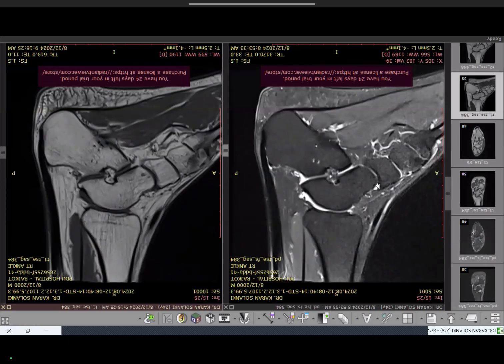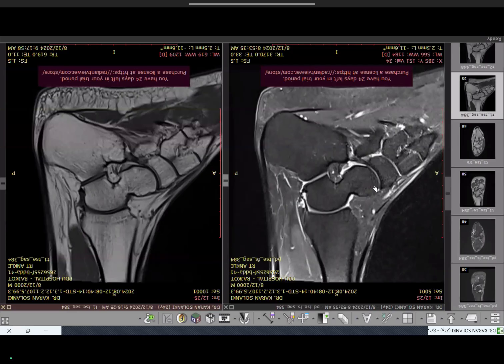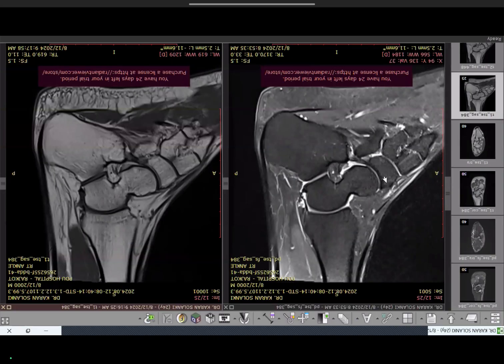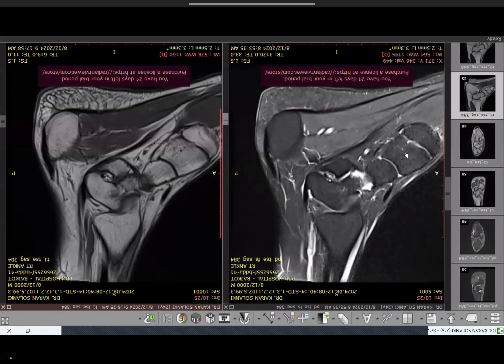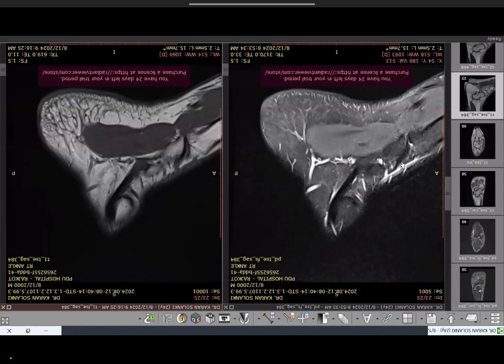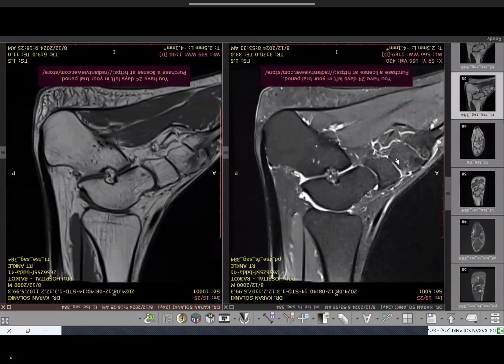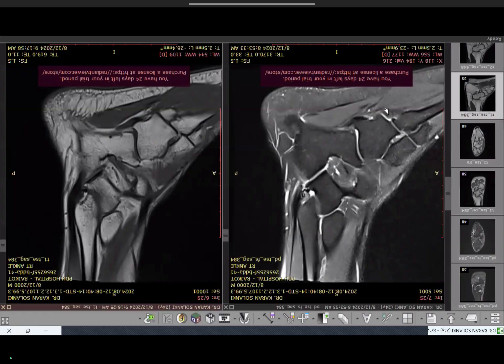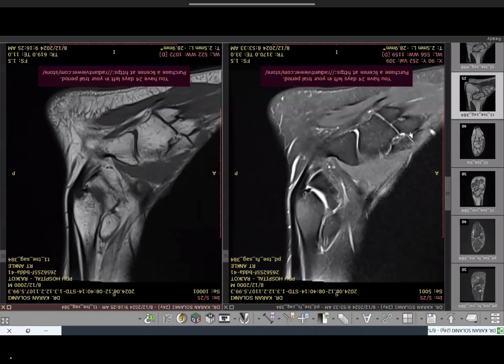The dark band at the talonavicular joint is the dorsal talonavicular ligament from the Chopart ligament complex. Then the navicular articulates with the medial cuneiform in medial sections; going more laterally you see the intermediate and lateral cuneiform bones — all three articulating with the navicular. Then the cuboid articulates with the bases of the fourth and fifth metatarsals. Any osteoarthritic changes at the midfoot-forefoot articulation should be mentioned in your report.